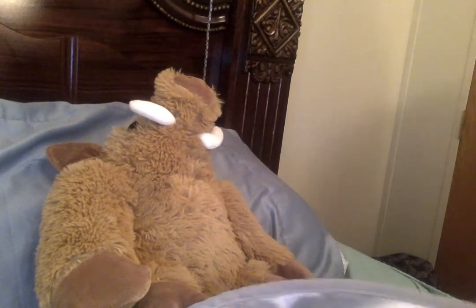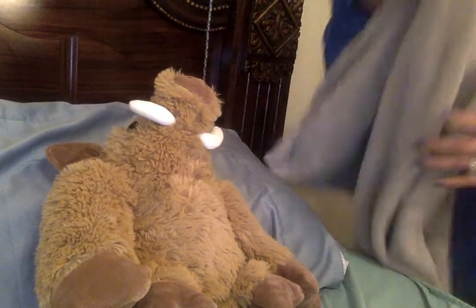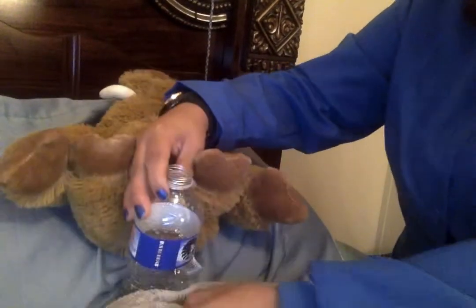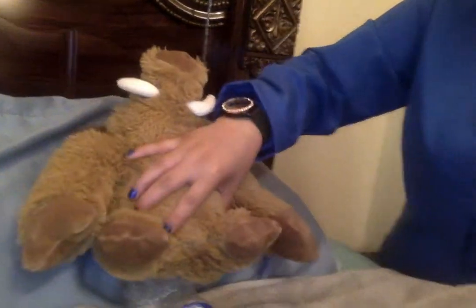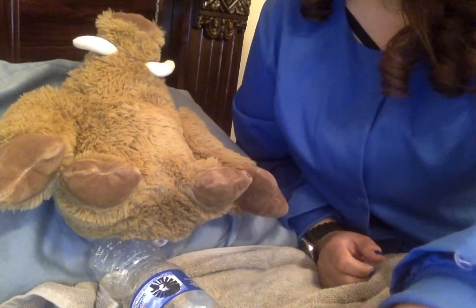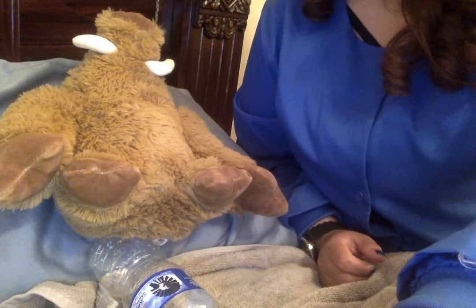So we can do that right now. Okay. And then we are going to gather up our necessary equipment and supplies.